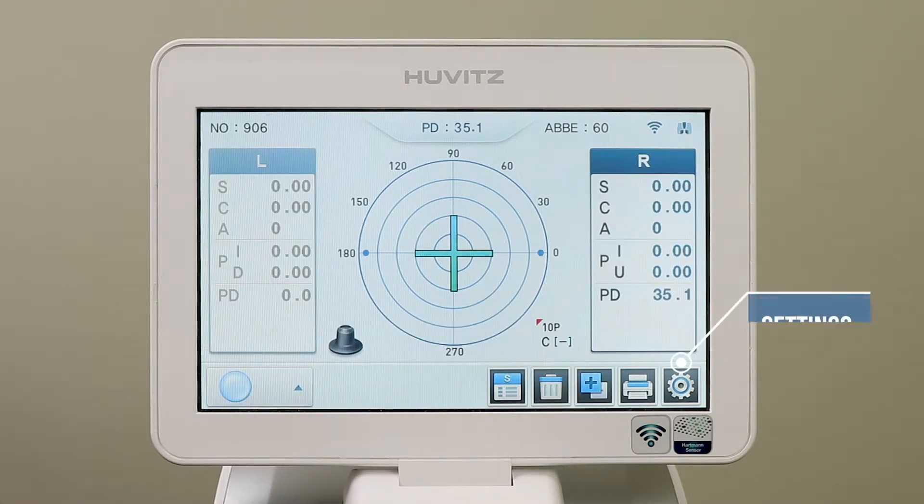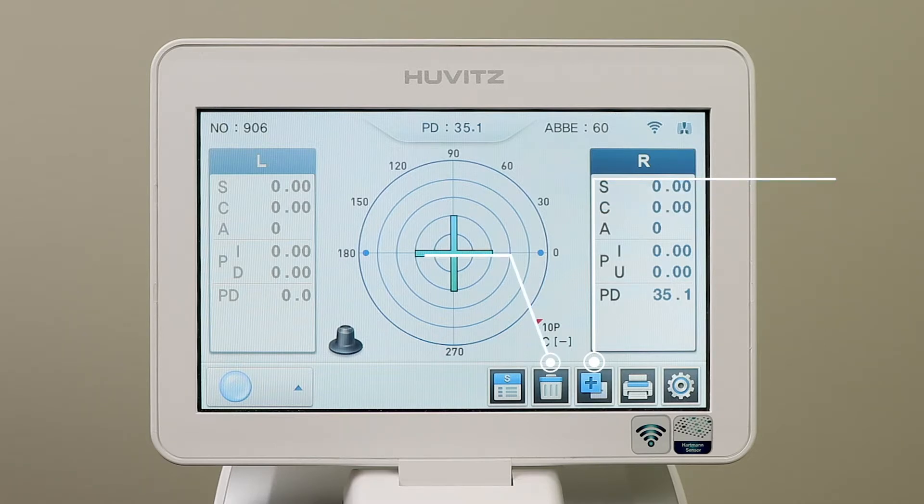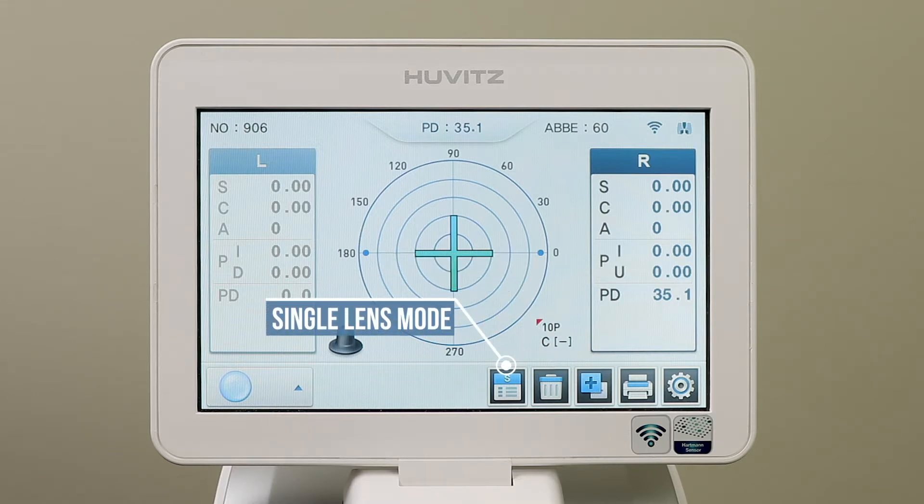In the bottom right-hand corner, you will see the settings icon, the printer icon, the plus and minus cylinder icon, the clear data icon, and the single lens mode and right-left lens mode toggle icon.